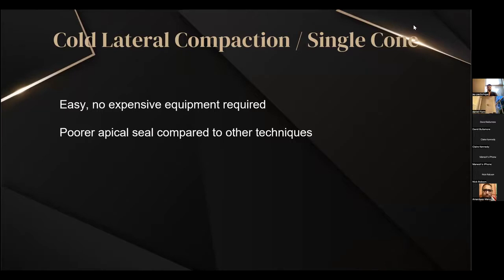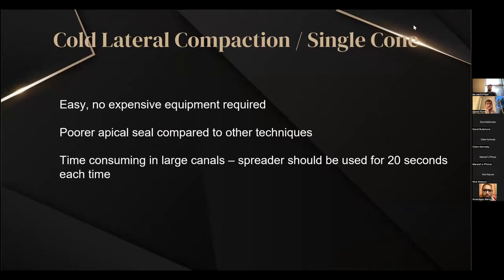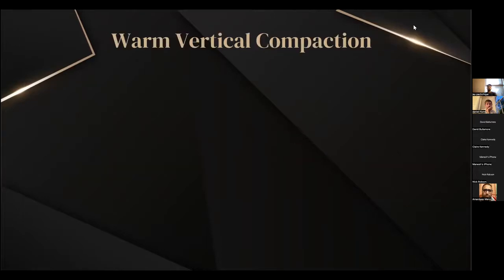So if you saw that apical delta picture at the start, if you imagine just placing a single cone into that tooth, you're not going to capture all that anatomy that easily. And in particularly large or oval canals, it can take some time. So your spreader ideally should be there for about 20 seconds each time in order to actually create that space inside the canal. You've then got warm vertical compaction.